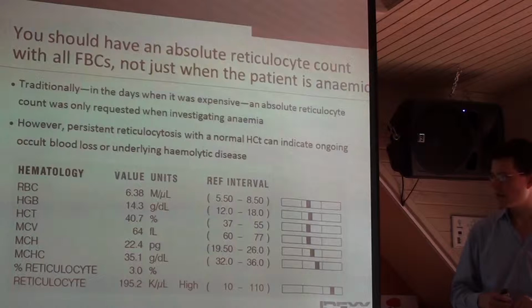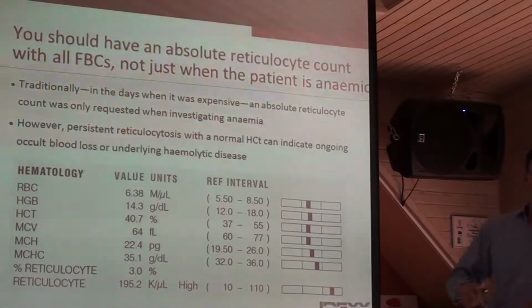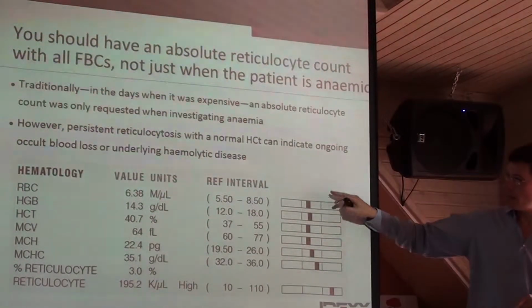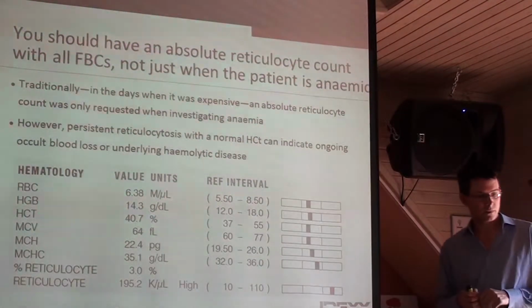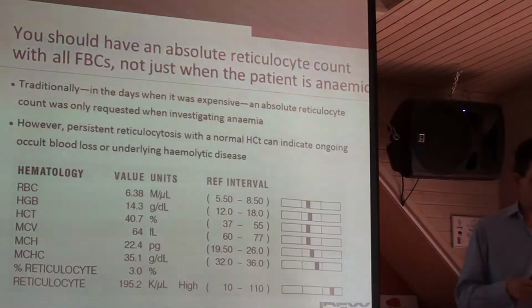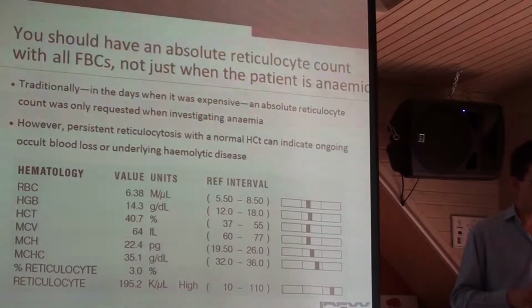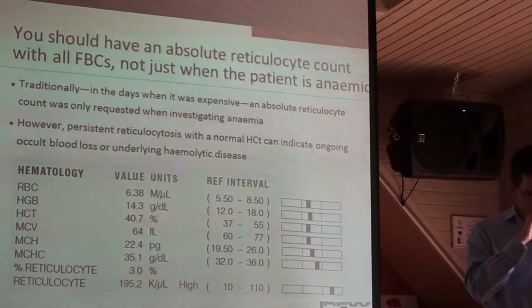So last week I was talking to some other veterinarians about the reticulocyte parameter, and they told me they only looked at the reticulocyte count if the patient was anemic.